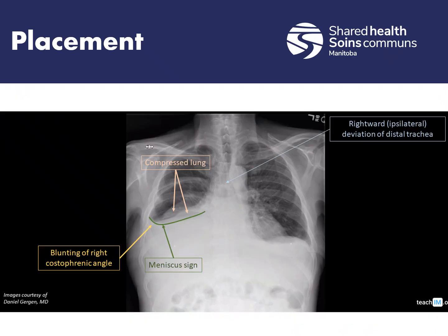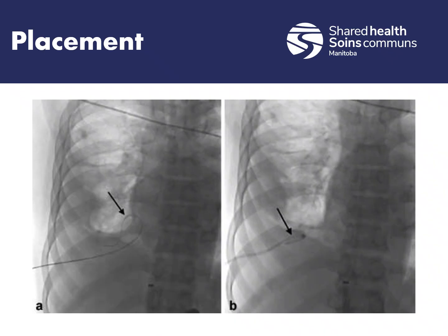We look at fluid. So this is a patient here with a moderate sized pleural effusion with some consolidation in the lungs. With that, we're probably going to put the chest tube lower down in the chest to help that fluid drain. Something like this here. So this is a 74-year-old male with a history of hypertension, diabetes, and was having shortness of breath. When they checked his chest, they found he had a bunch of fluid in his lower lobes. So they put a smaller pigtail, as I mentioned before, into the base of the lung to help evacuate that fluid from that pleural space.